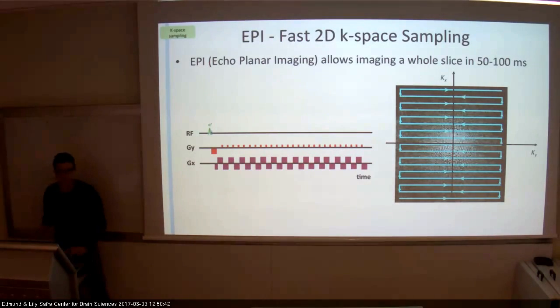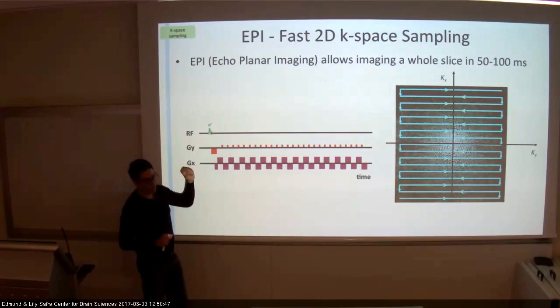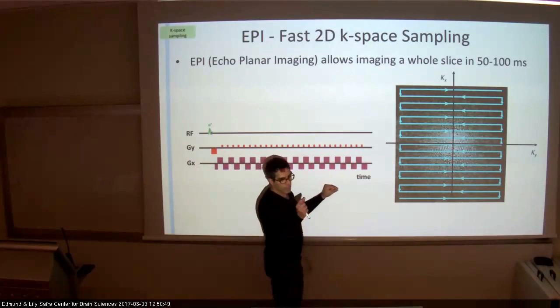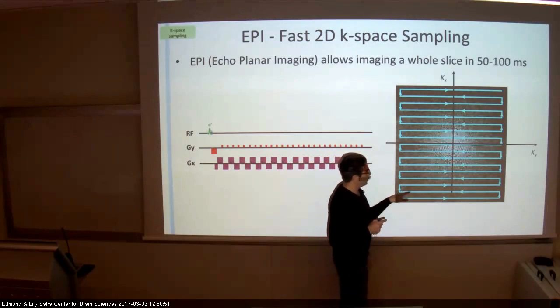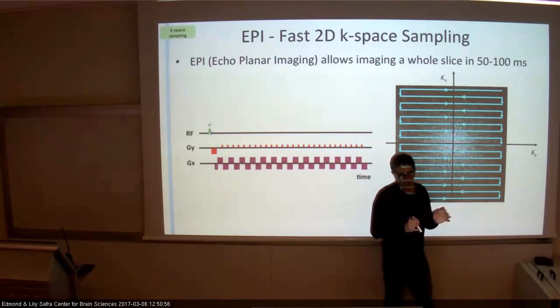You didn't understand that. So before, we were in a specific position in K-space, and we turn the gradient on, and as we wait with time, we kind of acquire the full line in K-space. And now we need to do it again. Move ourselves to another location in K-space, excitation, measure the full line in K-space.